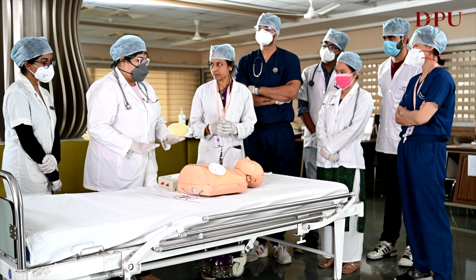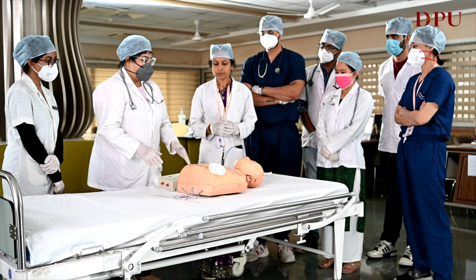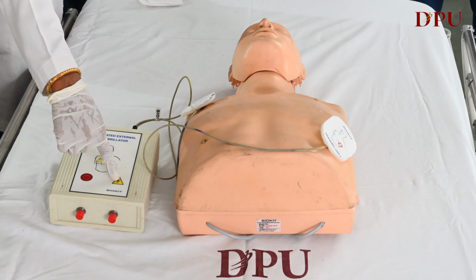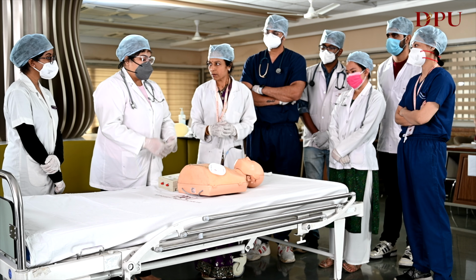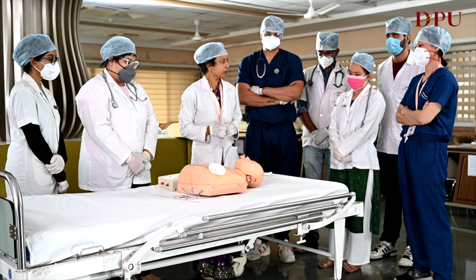If the machine says the shock is advised, I'll ask the people to clear and not touch the patient. I'll see visually that the patient is not being touched, and then I'll press the shock button. So this is the shock button. It will get charged and the patient will get a shock. Immediately after the shock is given, I'll start compressions. Excellent. She will resume the compressions.